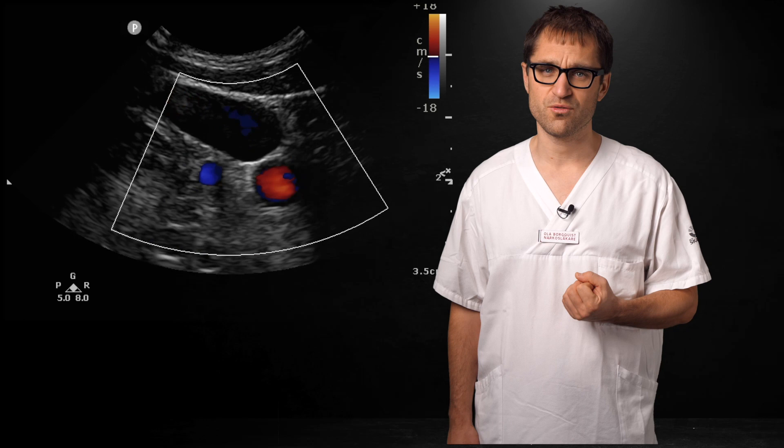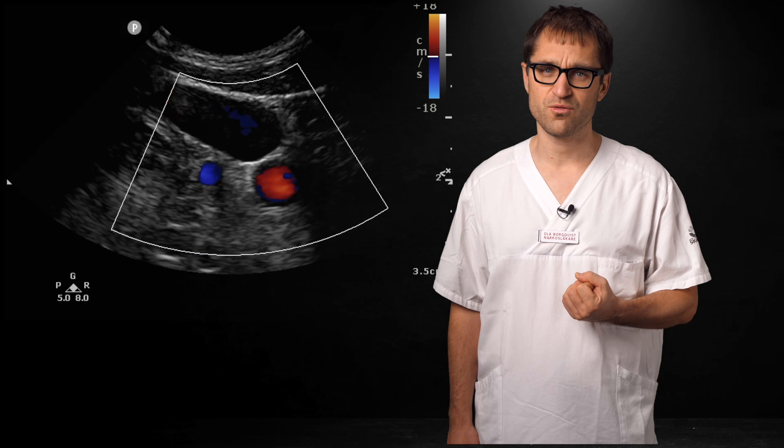If you are uncertain, use color Doppler and it should become obvious which is which. Don't cannulate the blinking warning light.